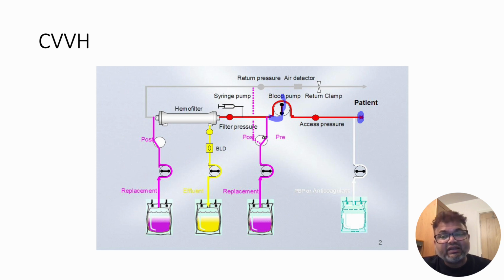With the use of citrate, it has definitely improved, because citrate doesn't cause clotting inside the body, because it gets neutralized before reaching the body by calcium. So we usually divide as a post filter 2/3 and pre filter 1/3, and then we go from there, and then we keep watching on the risk of clotting by monitoring transmembrane pressure.